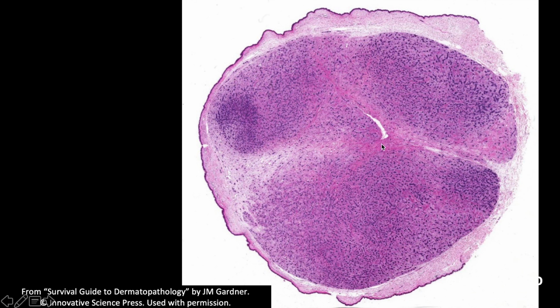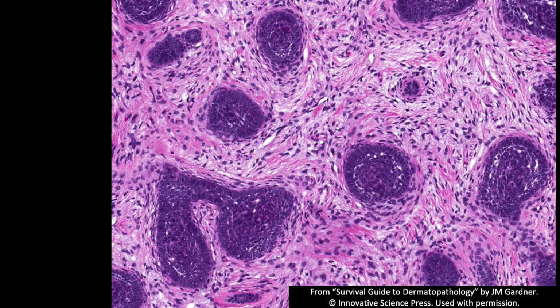A basal cell carcinoma wouldn't make this perfect marble of tumor that's completely separate from the surrounding dermis and not touching the epidermis at all. That right away should be a clue that this is probably not basal cell carcinoma. That's not how basal cells grow. And then when we look closer, the stroma is cellular. It has a lot more spindled fibroblastic cellularity. And the cells, look what they're doing. Instead of being split and clefted away from the tumor nest, they're hugging, tightly wrapping around the edges of the tumor islands. We don't see any papillary mesenchymal bodies here, but we do see that cellular stroma clinging to the basaloid cells.